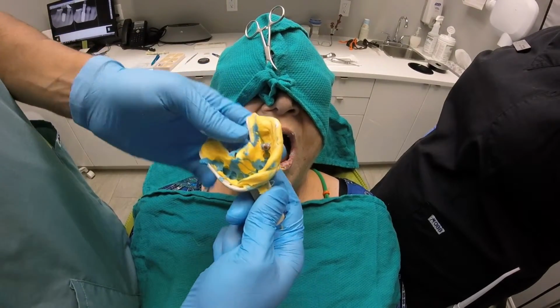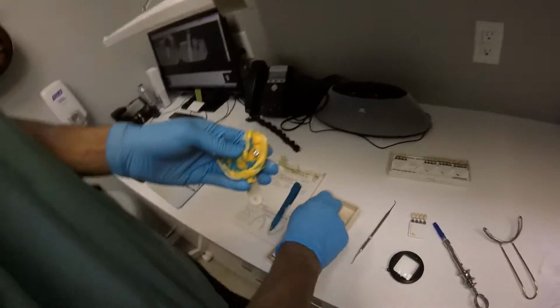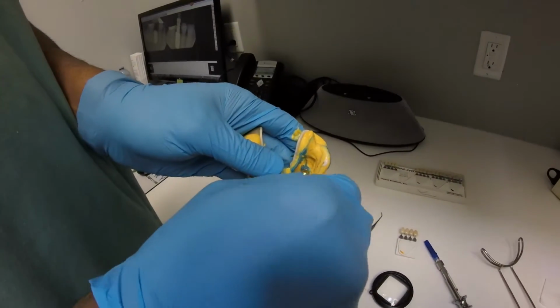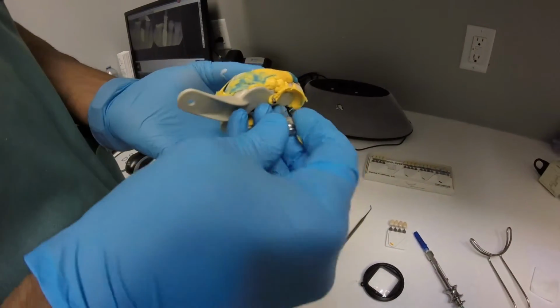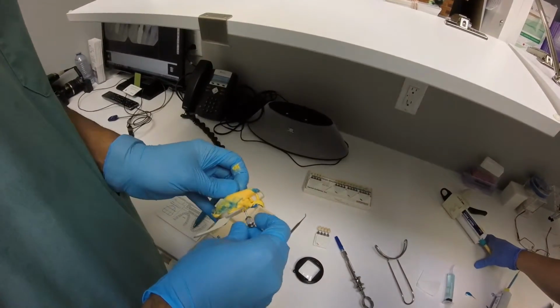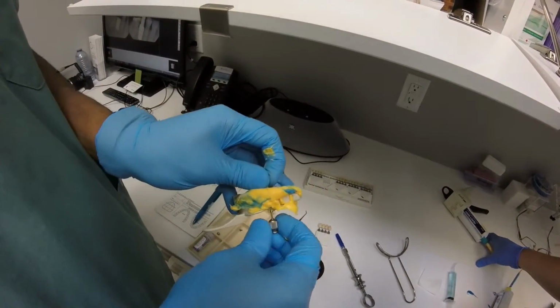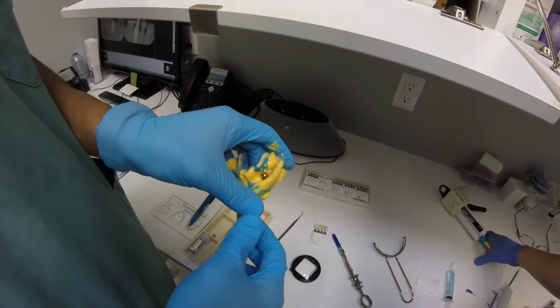I usually stock these in my office myself. This would be the actual fixture analog, so an analog of the implant. And this is the secret to screwing these things in. You don't want these things to rotate, which is why I don't like the lab doing it. You get some rookie lab person, you end up getting a lab error. So you just screw it in like that. You hold the thing, and you don't hold the impression tray. And you saw it rotate around there in my finger. That tells you that the whole thing is in.